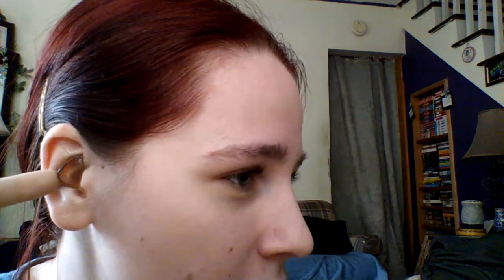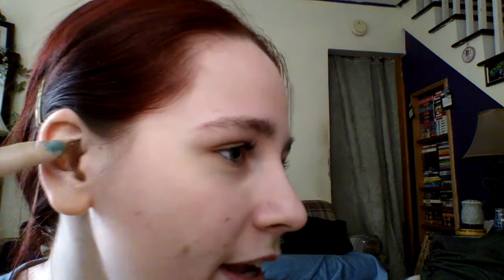Now I am going to show you how to take the filter out. I want to tell you that the only reason the filter comes out is because you take it out. If it feels like it's going to fall out, or it has fallen out, you need to send it back because it does not fit right. So now to actually take it out, all I do is put my nail or my finger underneath this curved part by my ear, and then I just pull it out like that.